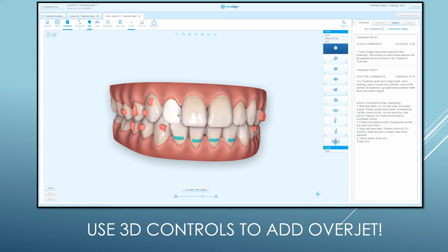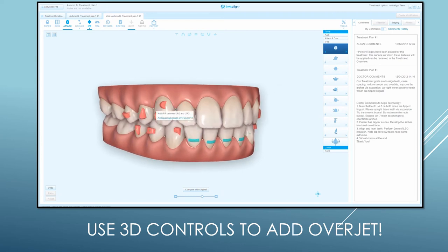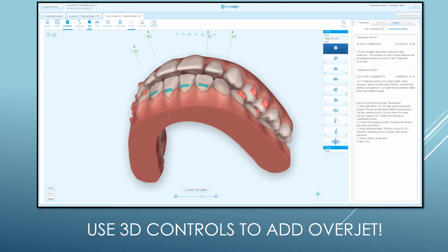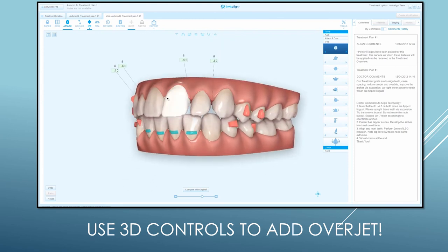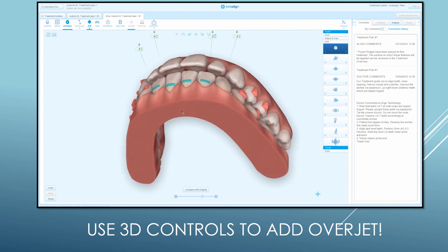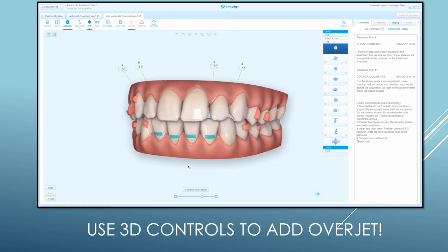What I would do is use the 3D controls and set this up so there's a little excess overjet. One thing I notice is that these are really small teeth. So I'm going to right-click and add spacing around the lateral so I can add some composite and make them more normal width. When you add the spacing, you can see the real-time effect — the anterior teeth are moving out a little more, creating some overjet. By resolving this tooth size discrepancy, you can create the excess overjet needed. If I had done this originally, I would not have had the problem.